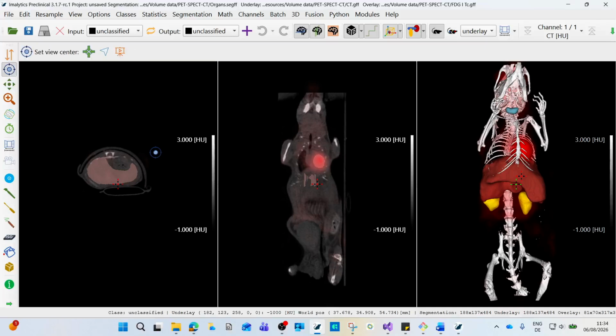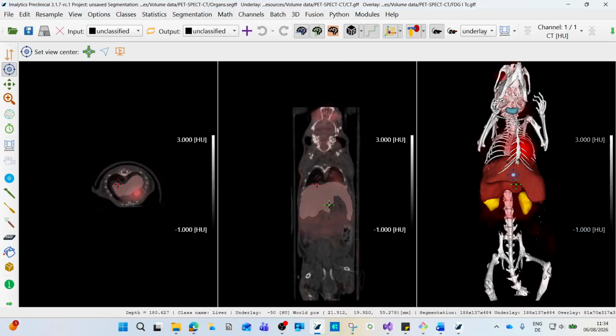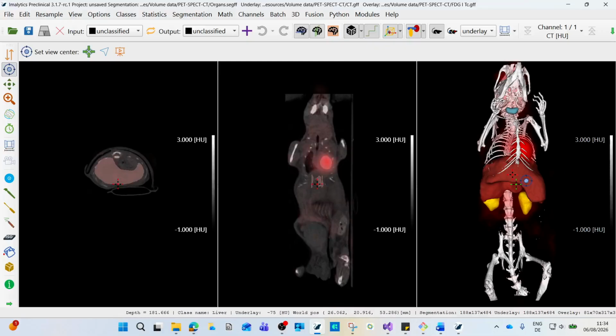This mode centers the view on a selected point, so it's resetting the viewing center, symbolized by this red crosshair. You can find it in the 2D slice views here, or also in the 3D rendering here. It's especially useful when you want to center on a specific structure, for example an organ, a tumor, a metastasis, or a specific region of interest.